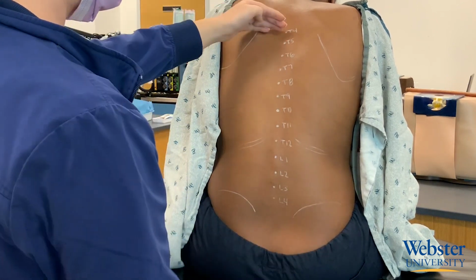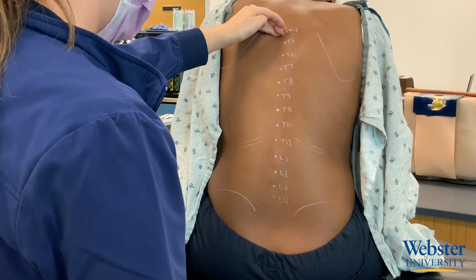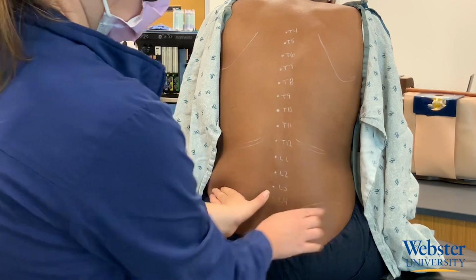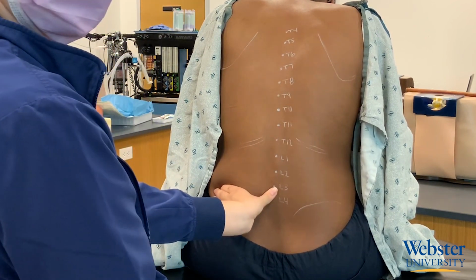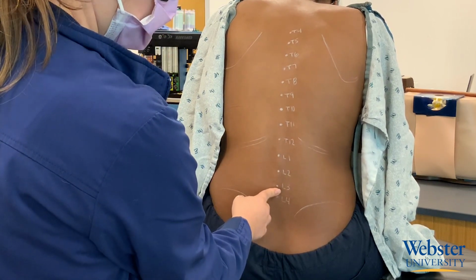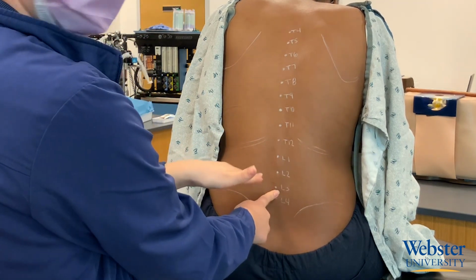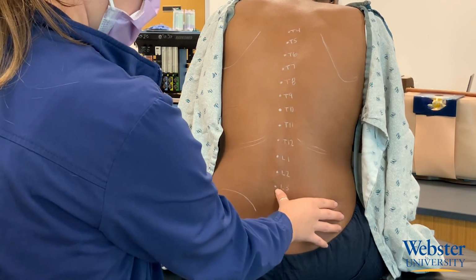So once again, once you have identified L4, the ideal location to place the epidural catheter is in the L3-4 interspace. Mark this space using your nail or something else to put an indentation into the skin. This way, when the area is cleaned, it is easy to identify exactly where the skin puncture will be. Since L1, L2 is where the spinal cord stops in 90% of people, we will want to be well below this level to prevent damage to the spinal cord.